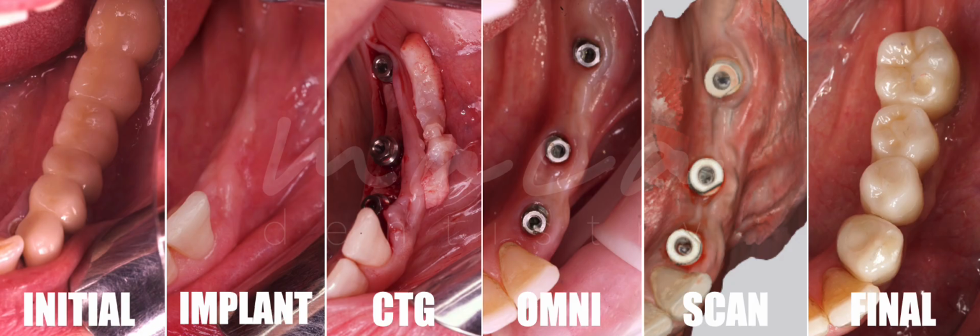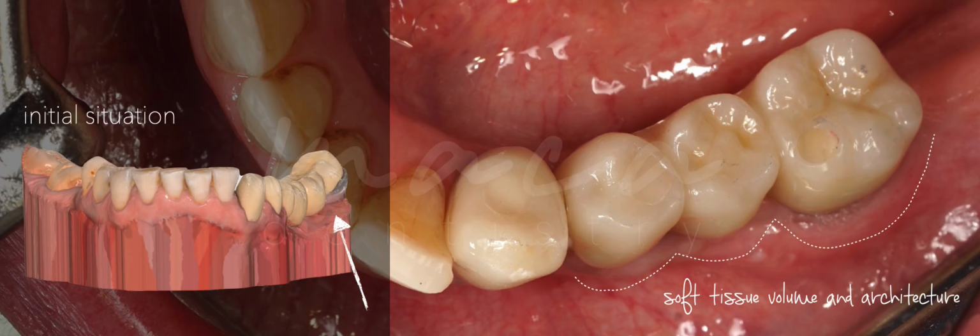Then we can see the workflow of the lower restorations. So initial situation, the implant placement submerged, then the second stage with the connective tissue graft, the OMNIs and the healing of the tissues, the scan, and the final result. And here you can better understand how we went from a situation with almost no soft tissue to the final situation where very healthy soft tissue with proper volume and architecture is visible around our implants and crowns.